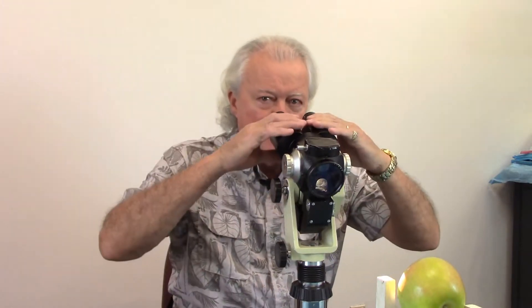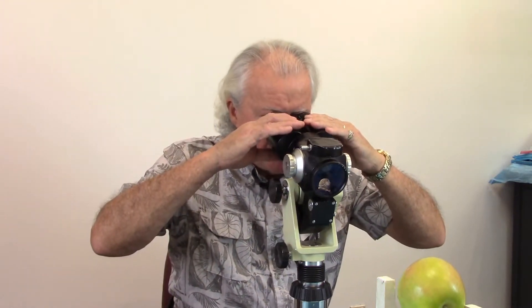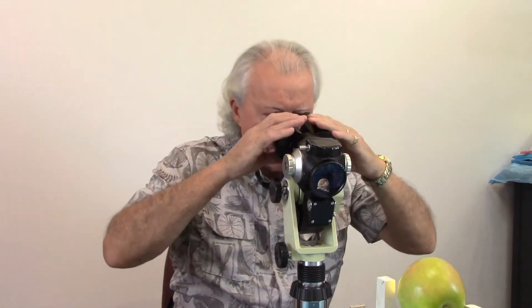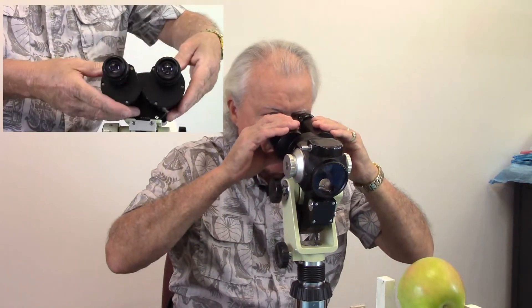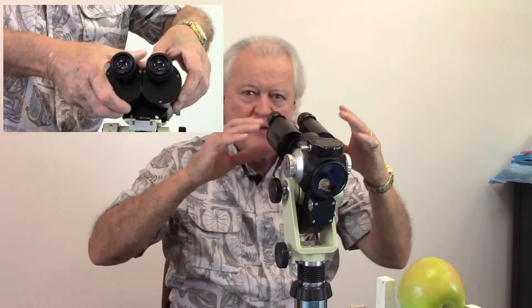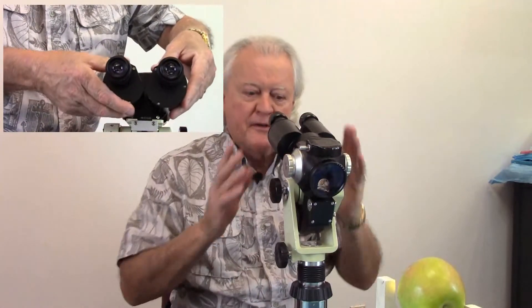I now set my interpupillary distance, just grossly. When you put your eyes up just barely touching, you want to see one solid round area that you're looking at. You don't want to see two separate dots that your eyes can't focus on. So I'm going to twist these back and forth with my eyes just off the oculars until I've got one solid circle that I'm looking through.